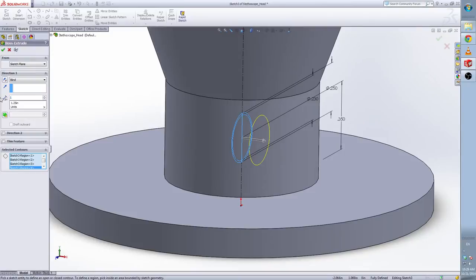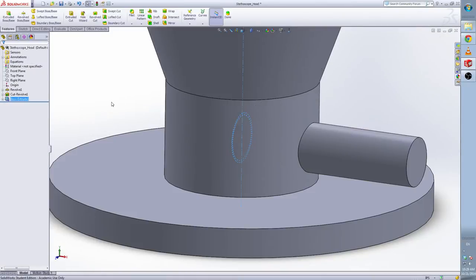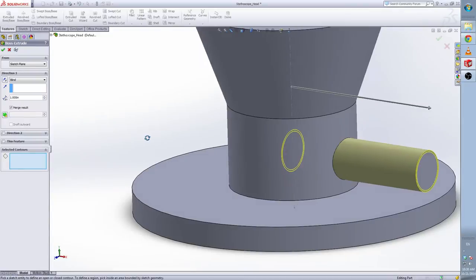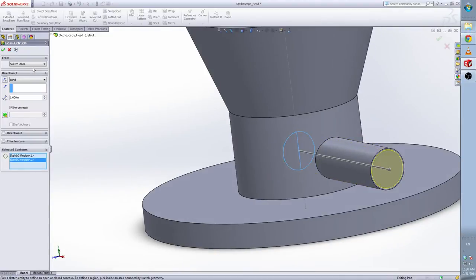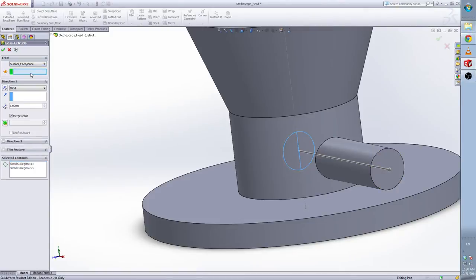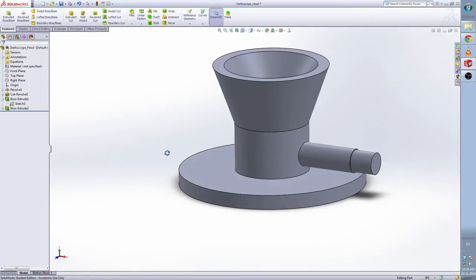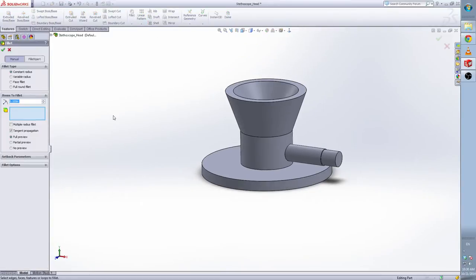The depth is 1 inch. We are going to use this sketch again, so show this sketch. Select the sketch and extrude the base. We clean this and I select the center one. Change to the surface of our face plane, select this face, and the depth is 0.25. Now hide this sketch. I want to give them some fillet — 0.05.